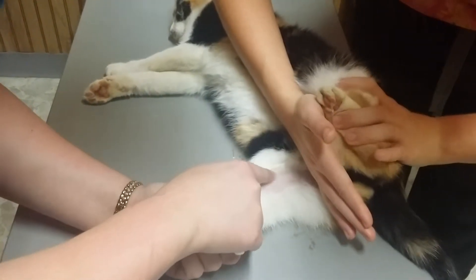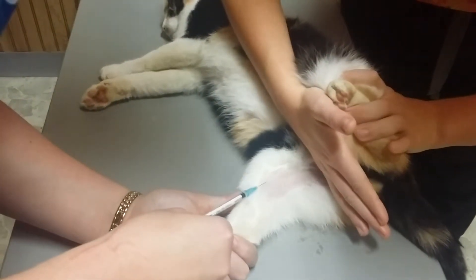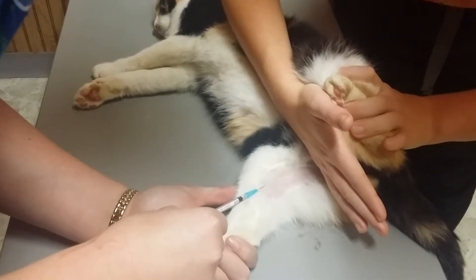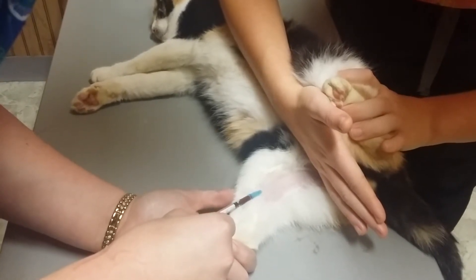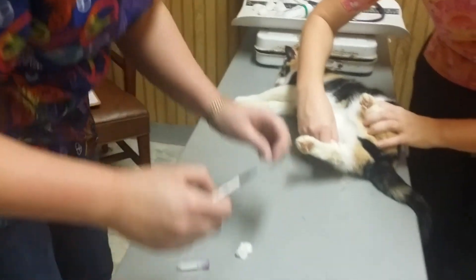I'm going to locate the vein. I'm going to make sure my bevel is up, and I'm going to ask Whitney to let off and hold and apply pressure for 60 seconds.